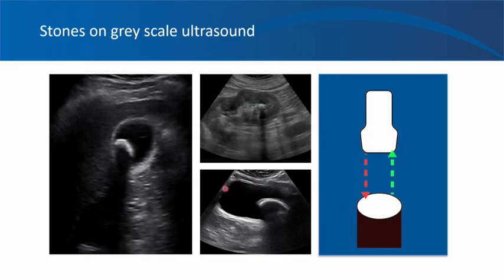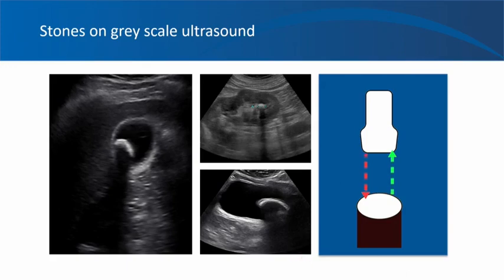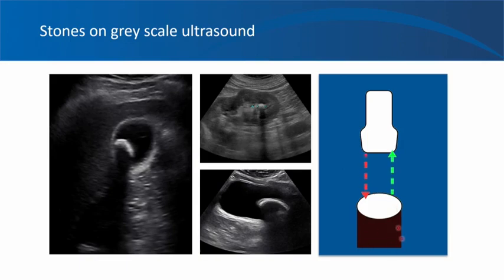And this is an example of a bladder stone where you can see a big horseshoe-shaped echogenic structure — that is the bladder stone — which is giving a shadow. This animation shows that the stone is not transmitting any sound and is reflecting most of the ultrasound beam, casting a shadow behind it.